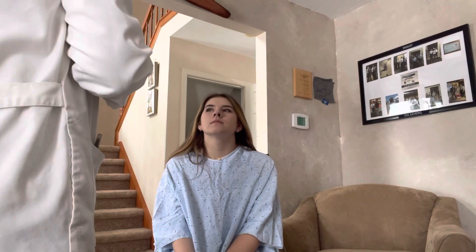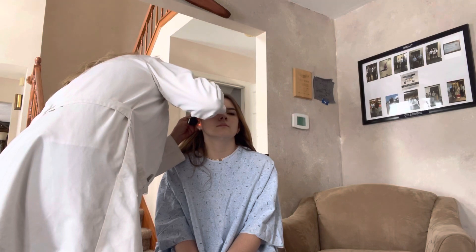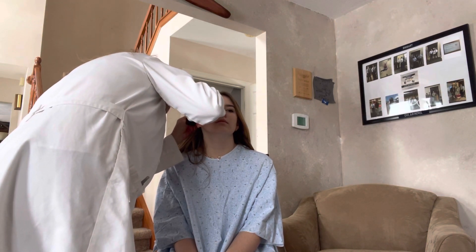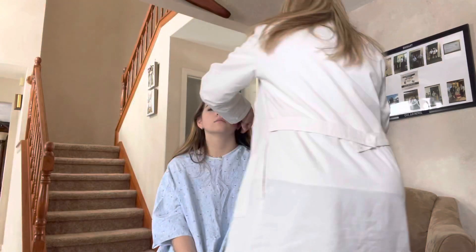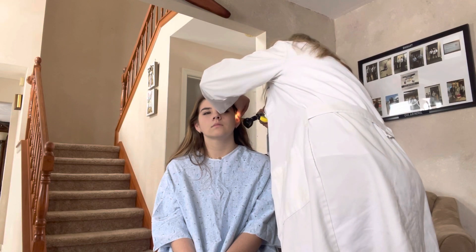I'm going to take a look inside of your ears — I'm going to pull this up and back. Everything looks nice. Your tympanic membrane is nice and pearly white. Your bone, your structure of your bones looks good. Going to go to this side now. Everything looks great there too.